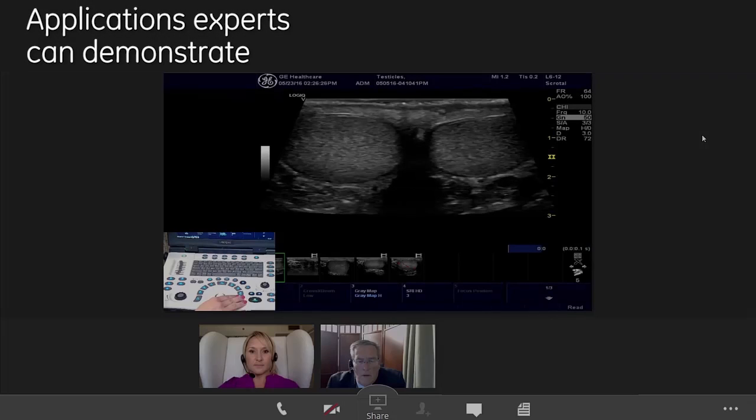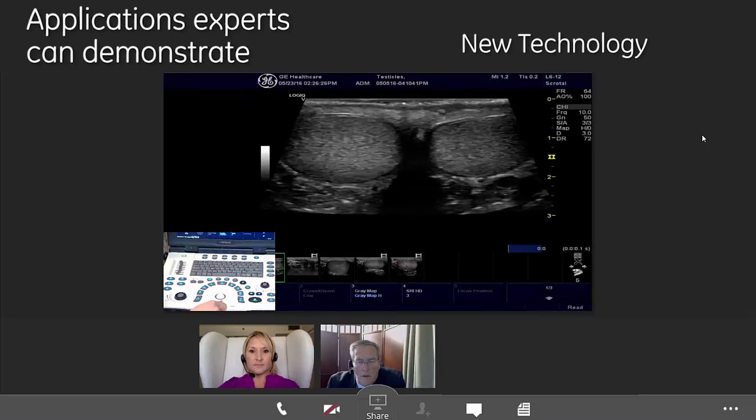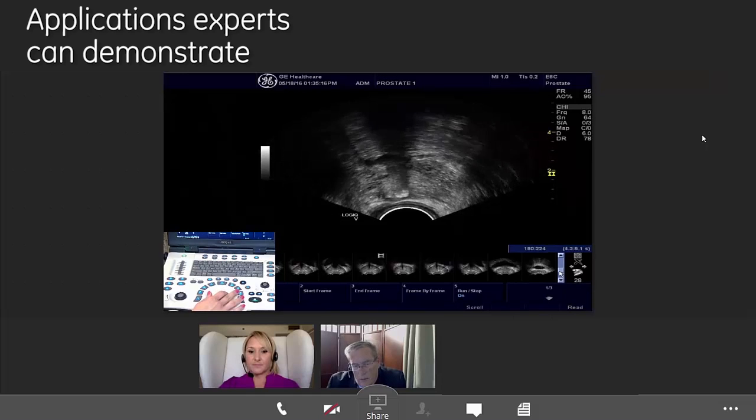We also have several customizable keys on here. We're able to tailor that machine to be a little more usable for you and what you like with your workflow. The first one has virtual convex, Dr. Bradley. That is a feature that will allow you to open up your linear transducer and make it a little bit larger field of view.